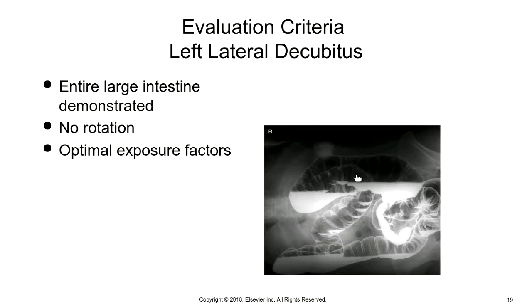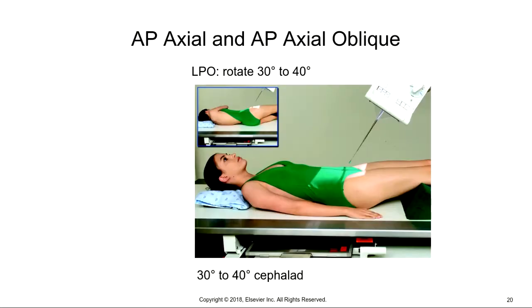So these decubes are vital to make sure that you get good air fluid levels in there and that you don't clip off any portion of the entire large intestine in either image. So we do our decubes and we go right into our normal routine.